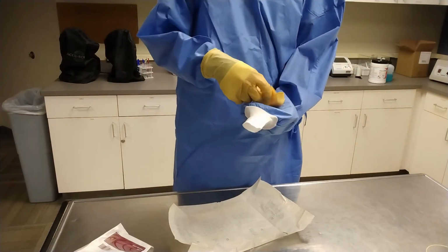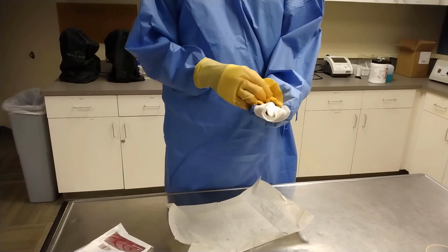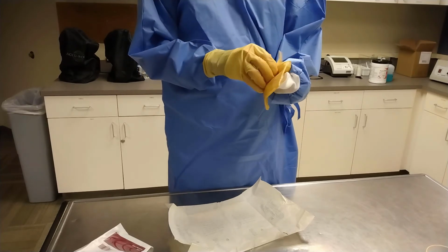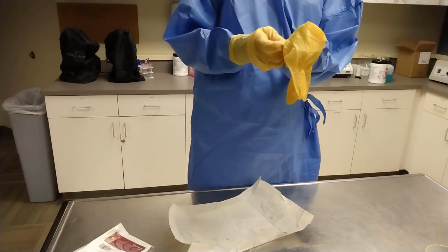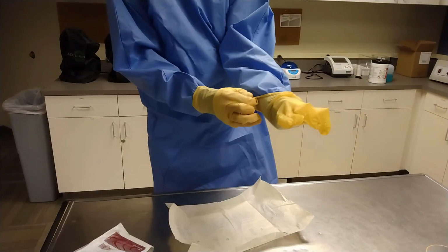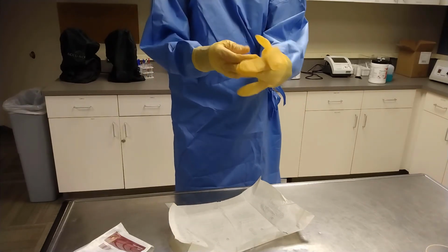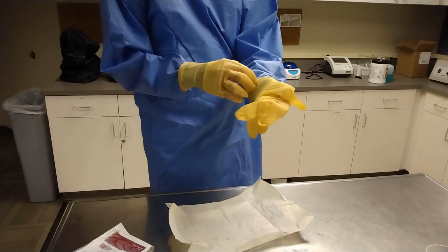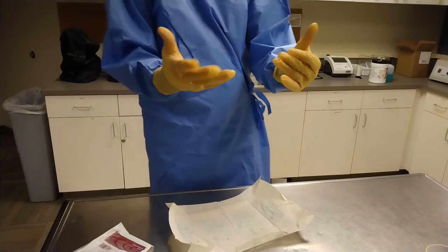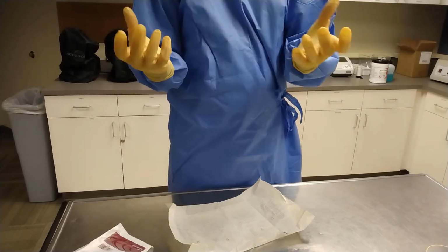So it's going to face me, right? So the fingers are pointing towards me with the thumb on the outside. So grab that, pull it over the top like that, and then work your hand to there. So now I'm sterile on the outside, and I can use my hands.